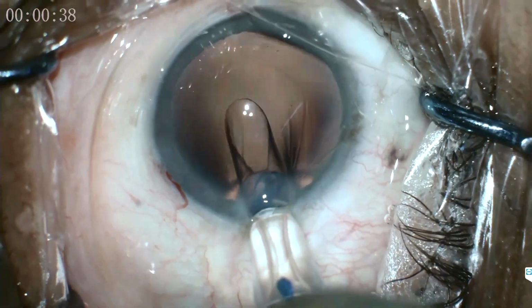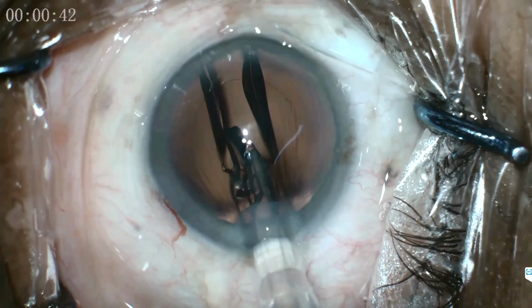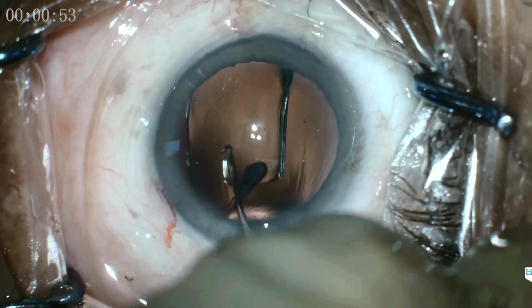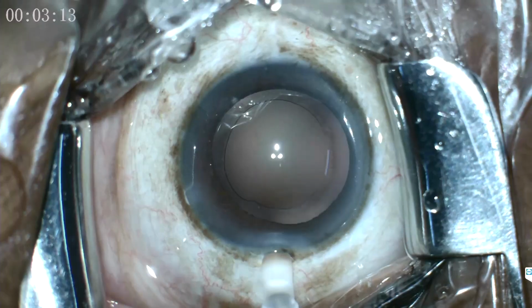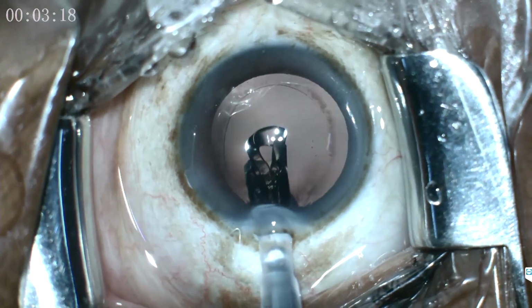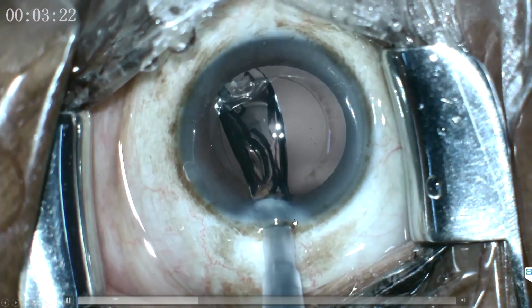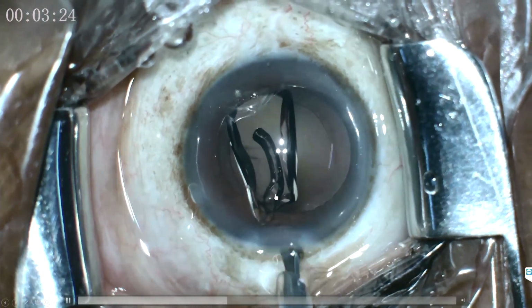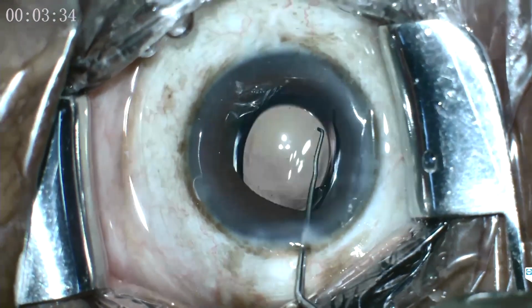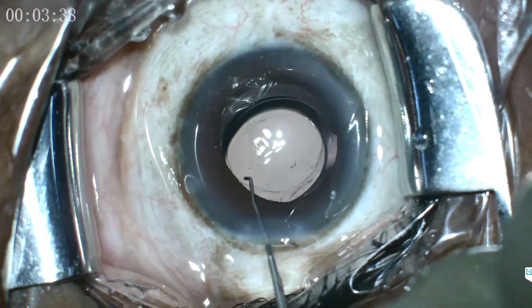You don't support in the side port and distort the wound. Incision distortion is a bad thing, so I recommend you not to do that; the incision should be good enough to go. This is an incision assisted system where you don't enter the anterior chamber. Just at the lip you put the cartridge and inject a single piece. These can all be done with single piece lenses or hydrophilic lenses. You cannot do this technique for a 3-piece IOL.